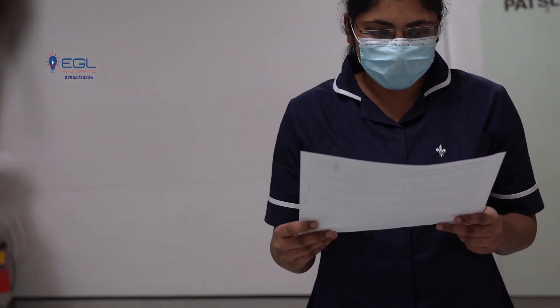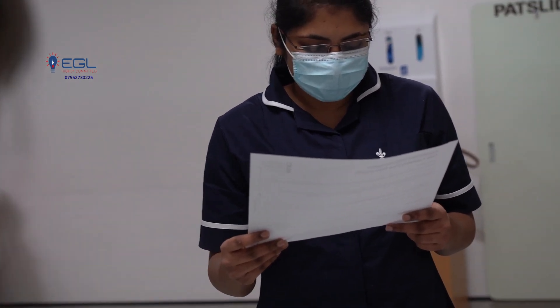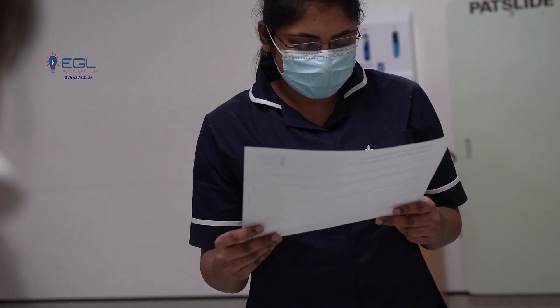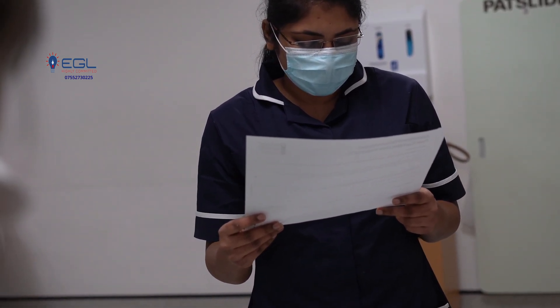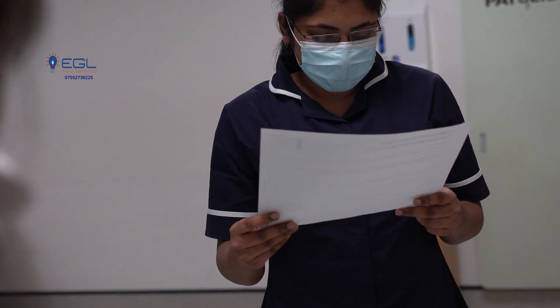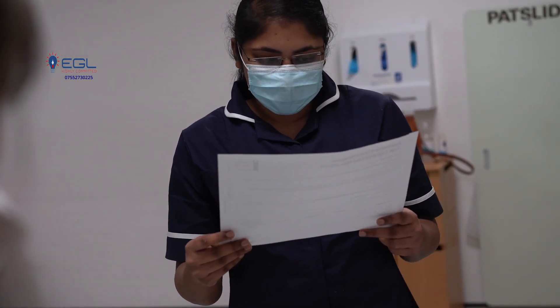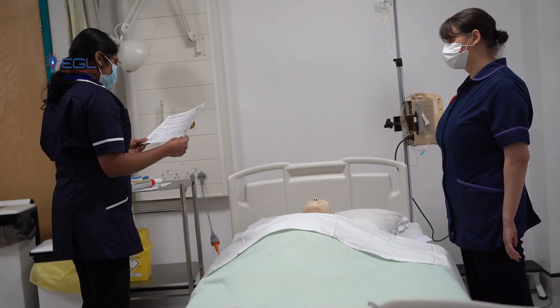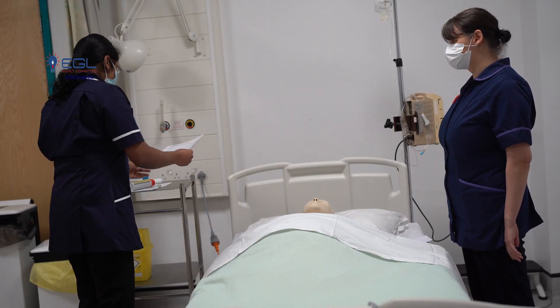I have assessment documentation for peak expiratory flow. According to this, your full name is Peter Williams, address is 2 Longstreet, date of birth is 28/01/1952. You are not allergic to anything, your height is 160cm and your age is 70 years. Is that correct? That's correct. The time for doing the peak expiratory flow assessment is today at 10 o'clock.